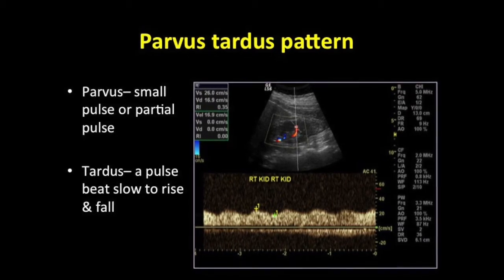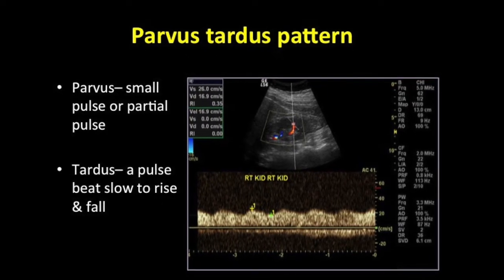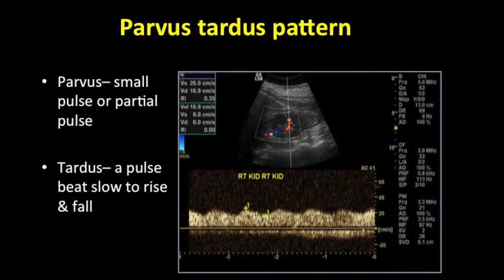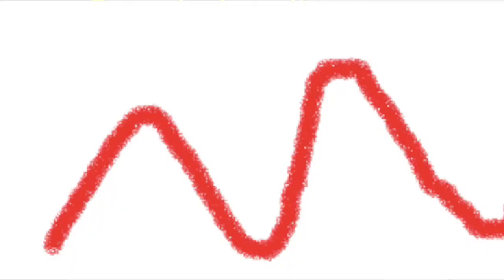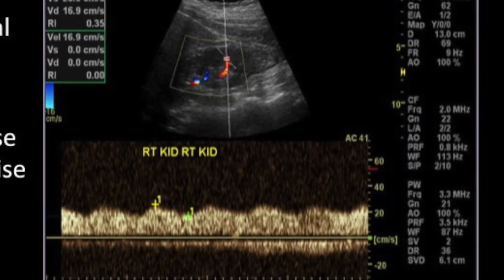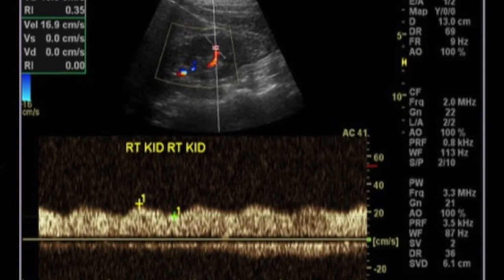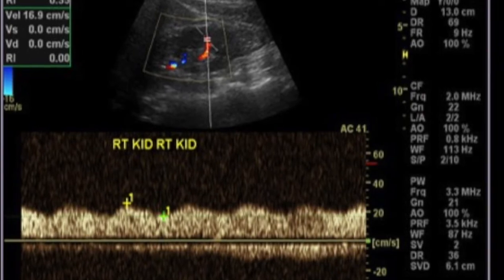What is the parvus tardus pattern? Parvus refers to a small or partial pulse, and tardus is a pulse slow to rise and slow to fall. This is a typical parvus tardus pattern.